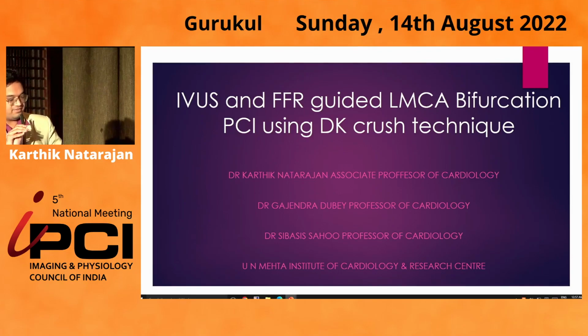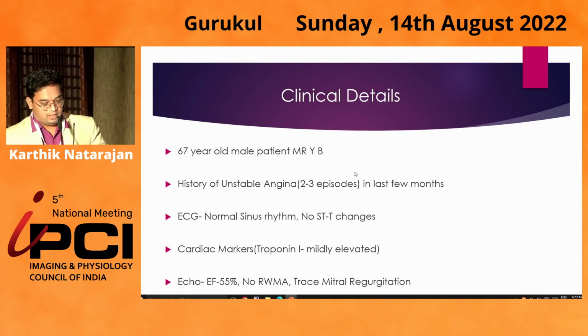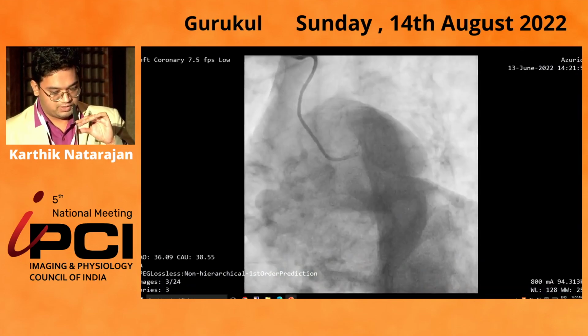I'll be presenting a case of IVUS and FFR guided LMCA bifurcation PCI using the DK crush technique. My patient is a 67-year-old male with a history of unstable angina in the past few months. ECG was normal, cardiac markers were mildly elevated, and the echo was normal.